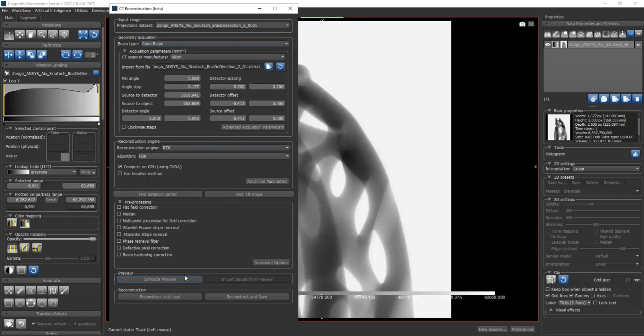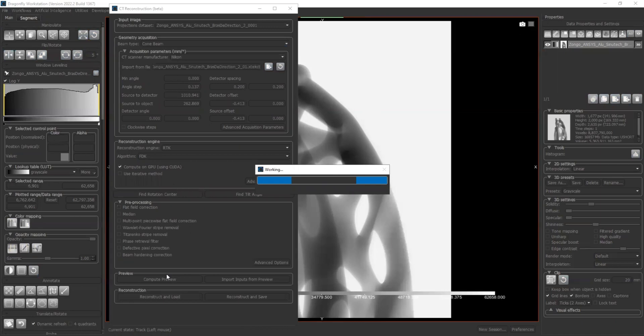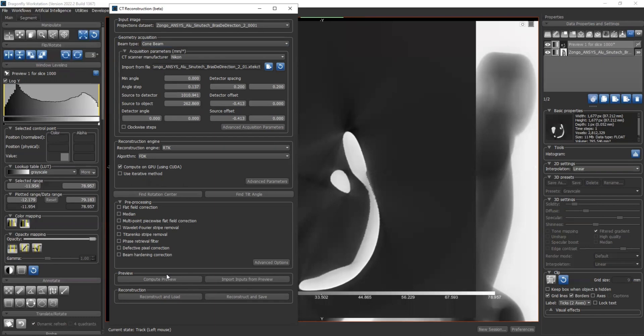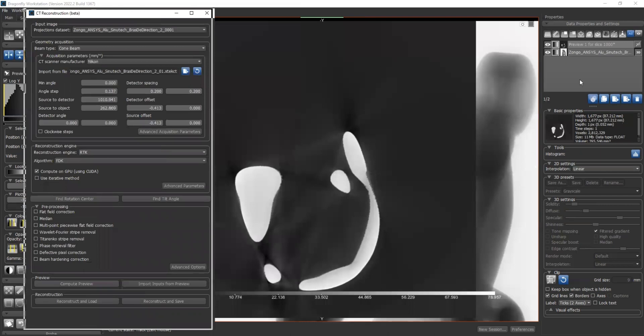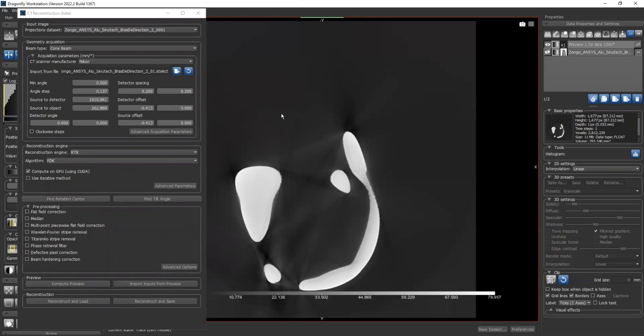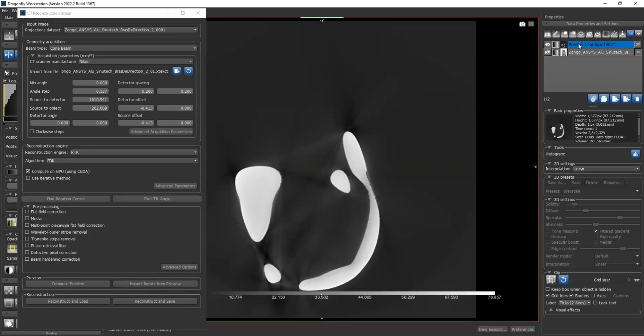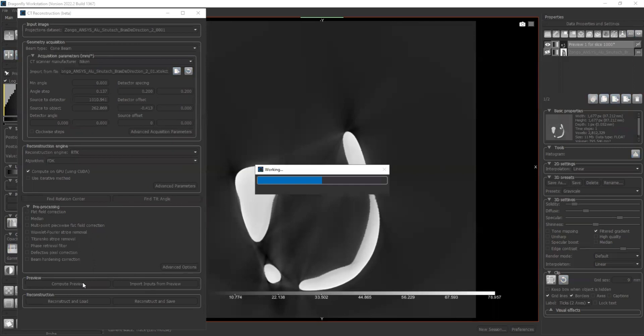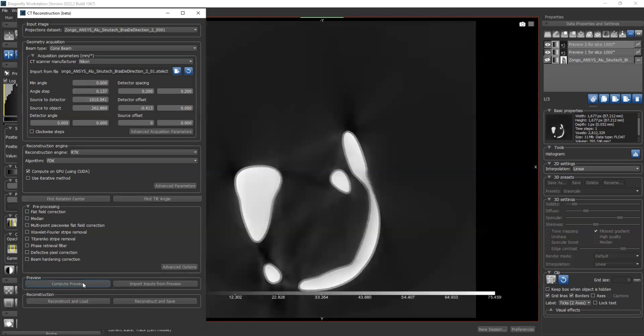Now I think we are all set. We can go ahead and compute preview. What it does is it's going to select the middle slice of your projection, which is slice 1000 for our case, and compute a preview. This is mainly for if you don't know if your parameters are correct, or if you have different sets of parameters or different reconstruction algorithms, and you want to compare which one gives you a better result. This way it's very fast. And once you have previews computed, let's say I have multiple different previews selected here. For example, let's choose the source offset as zero and compute another preview. And now I have another - it doesn't look very well - preview calculated.